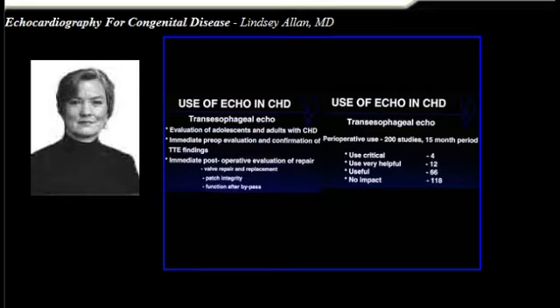But our main use for it is in the immediate preoperative evaluation in the OR to remind the surgeon of what he's seen at the cath conference in this particular patient, to remind him of the anatomy, to confirm what we've diagnosed on the transthoracic findings, and to check some of the things that we're not so good at seeing on the transthoracic echo.